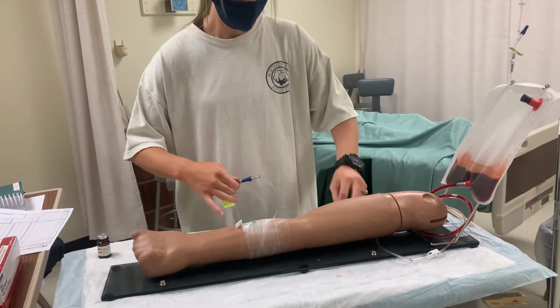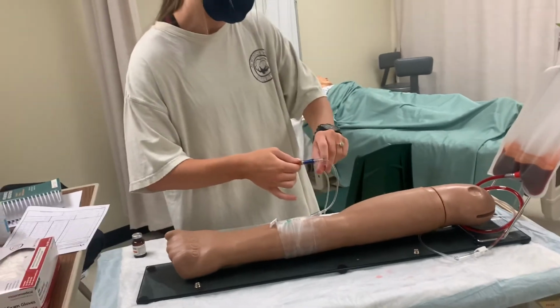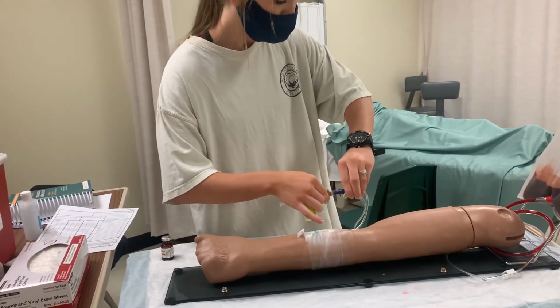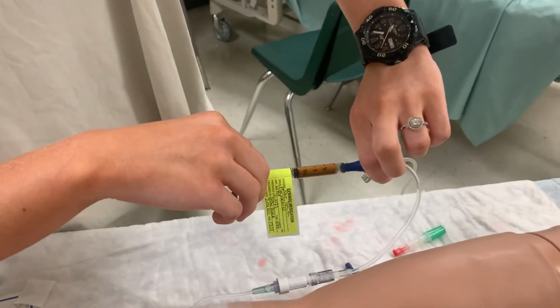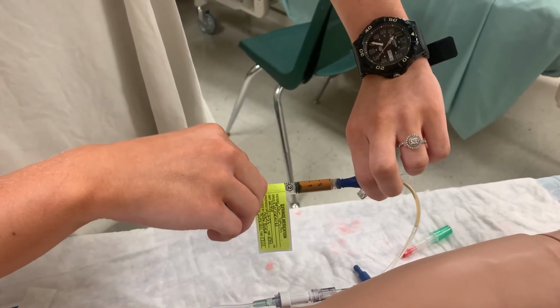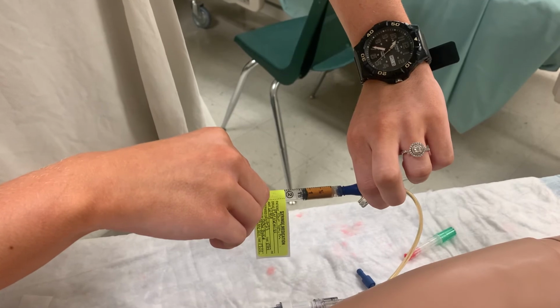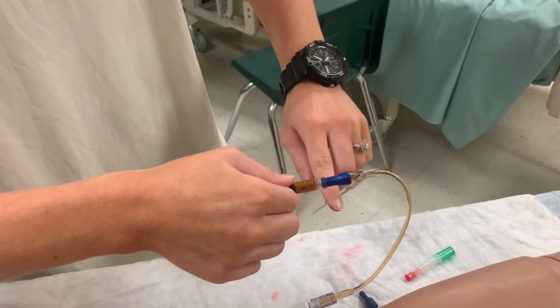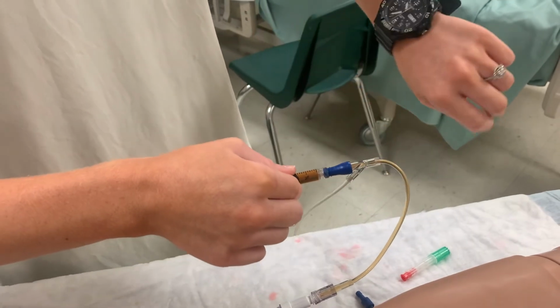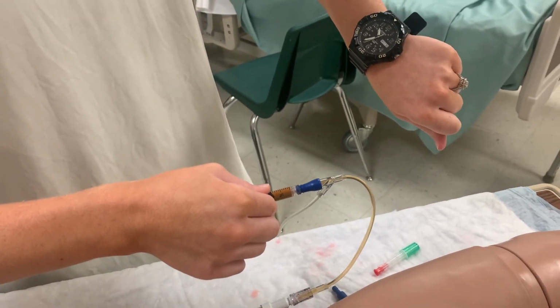So after I clean that, I'm going to push. I'm going to push 1 milliliter over 30 seconds. So I'm going to clamp. Alright, I'm going to push 1 whole milliliter with my line clamped. So I have my milliliter pushed. Now I'm going to unclamp for 30 seconds.